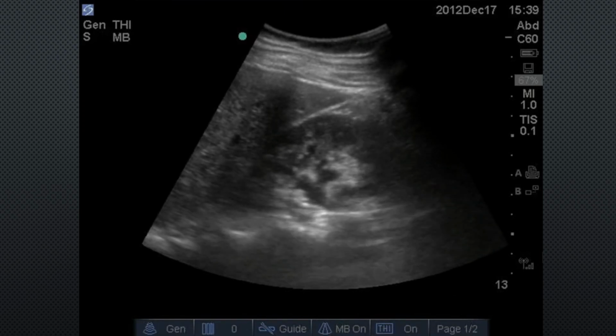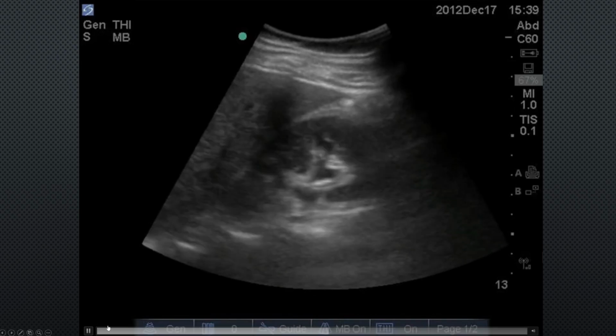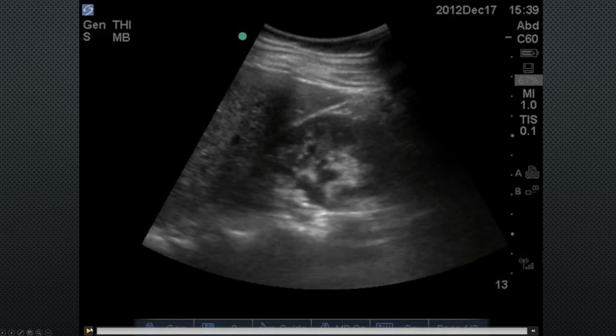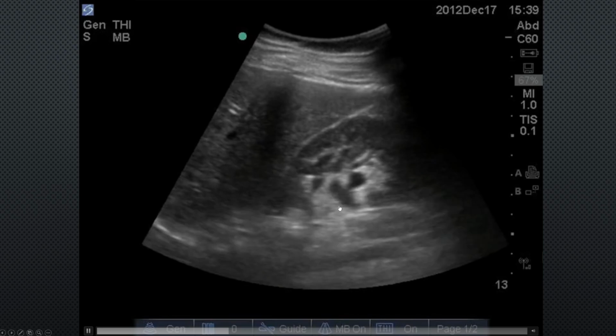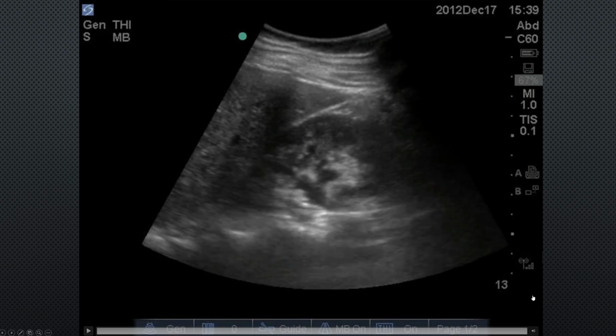Got another look at the kidney here, looking like potentially a little bit of just mild hydronephrosis just inside that renal pelvis, maybe edging into the calyces, but looks mostly contained in that pelvis. So I would say this is a mild amount of hydronephrosis.